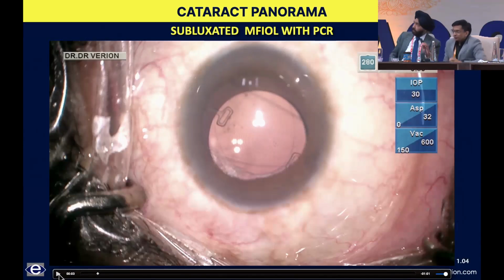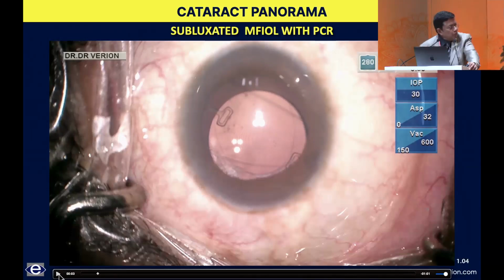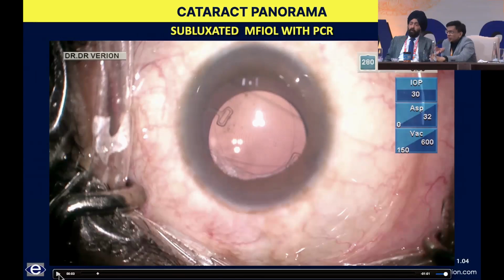This is a pure PMMA haptics? No, this is PVDF. Yes, this one. You can see the knuckle. This is a silicone lens, foldable with PVDF haptic. This is PVDF, exactly the one like how Zeiss guys have, no? The one which they're using in Germany. I've used those lenses that came later. This was even before that. Yes, I know, I've used this lens. And Ram, that was actually 3M that came up with the PMMA. All PMMA, yeah. You can glue this, Ram.